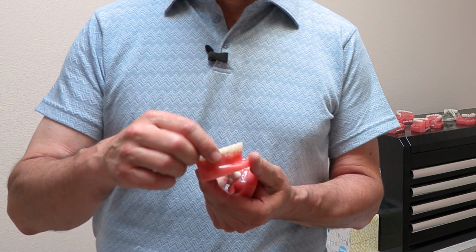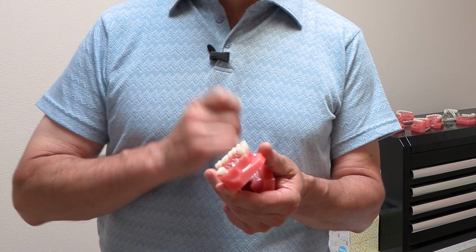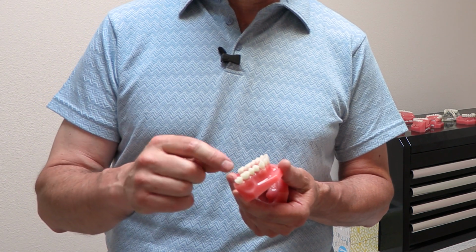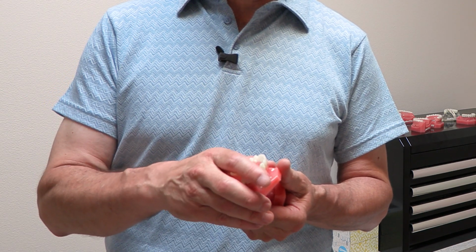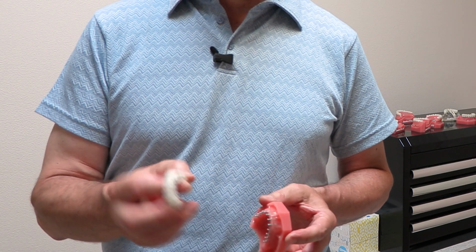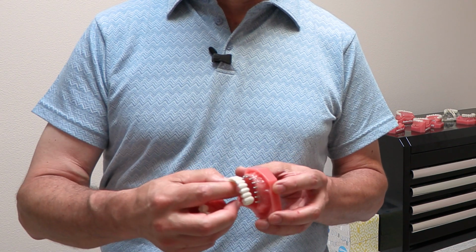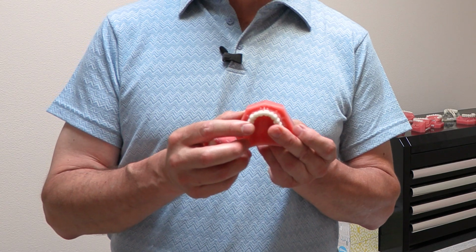When we talk about bridges with implants, we place some mini implants to replace the missing teeth, and we create a bridge. This bridge can be two teeth together or three teeth together, or even, if you're missing all your teeth in the top, we create a bridge. We place the mini implants, we cement it in, and this is a full roundhouse. It's a bridge that is cemented in your mouth.